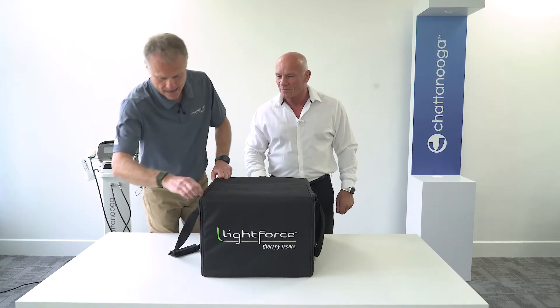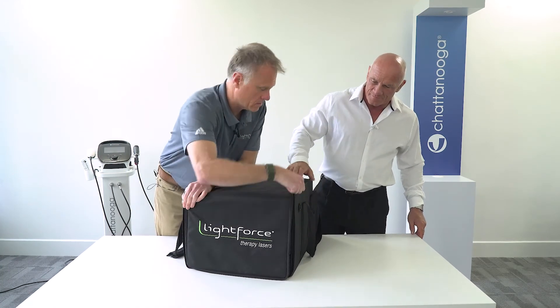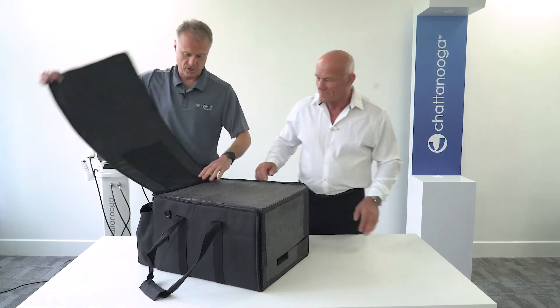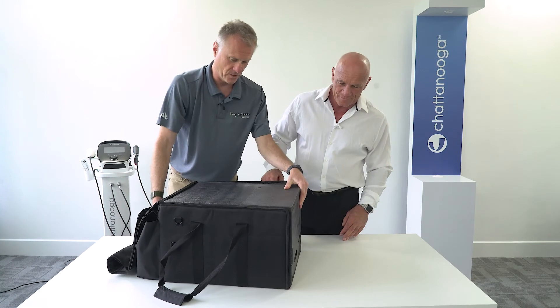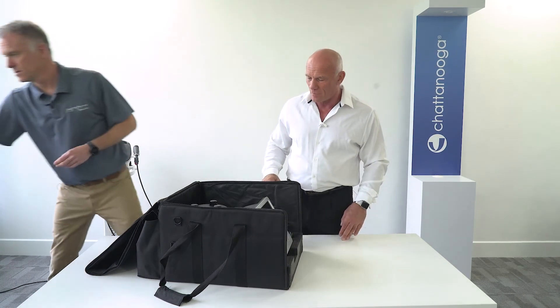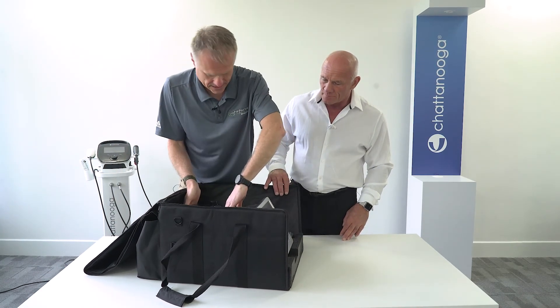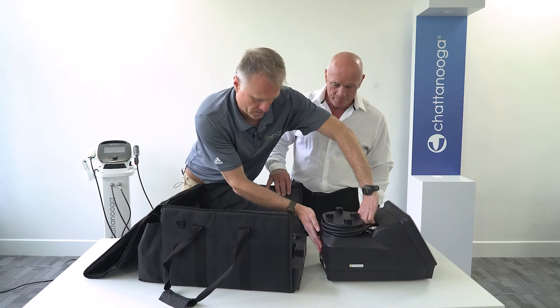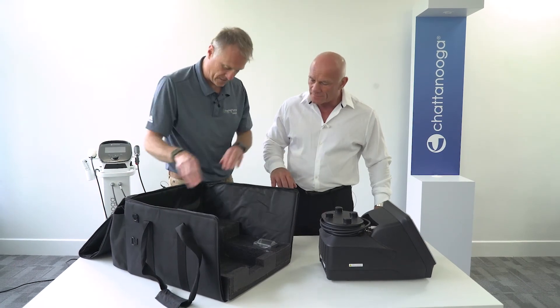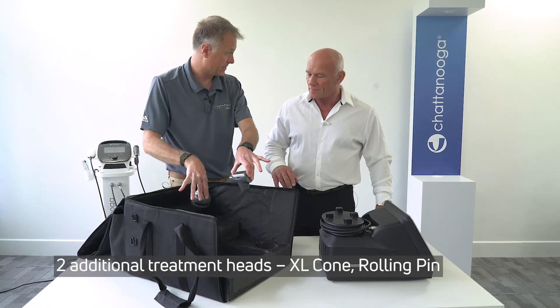So we unzip the bag like so, and then this just folds back. We've got some foam padding in there which we can take out. And then we have our XLI laser, which we remove like that. Also included in the packaging with this specific model, we have the two additional extra large heads as well, which are inside there.